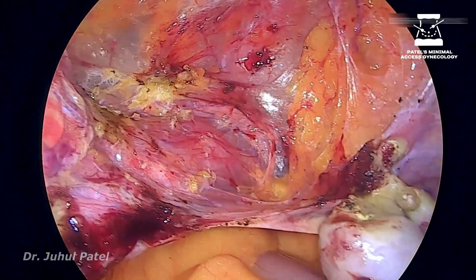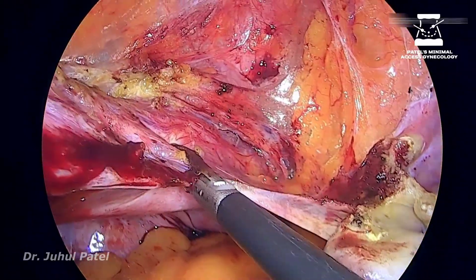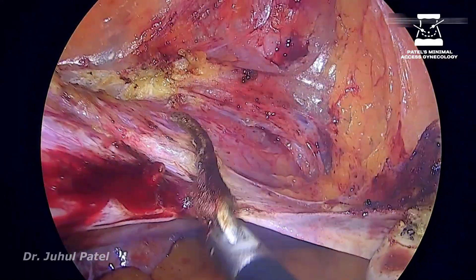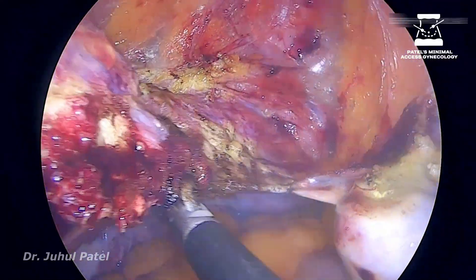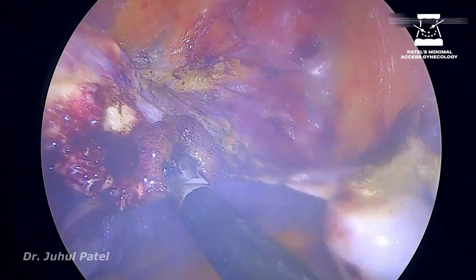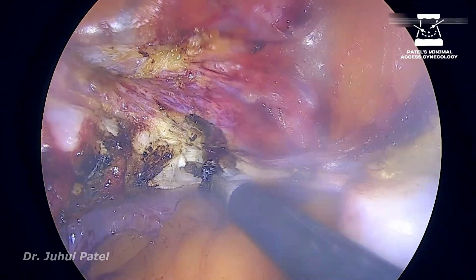Now it is time for the uterines to go. I will seal the uterine at three different locations — central, medial, and lateral — and then chopping in between.